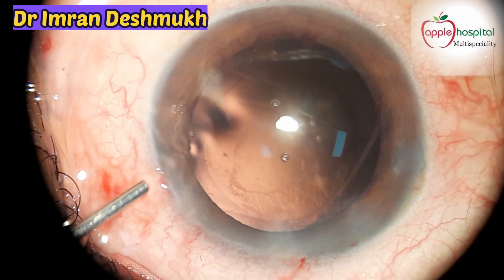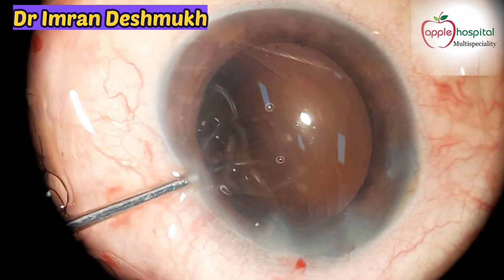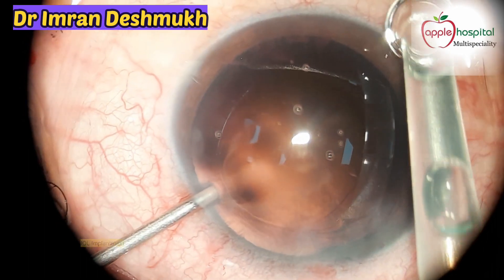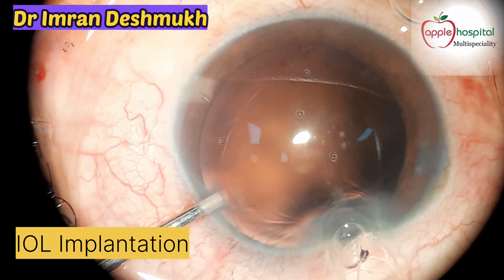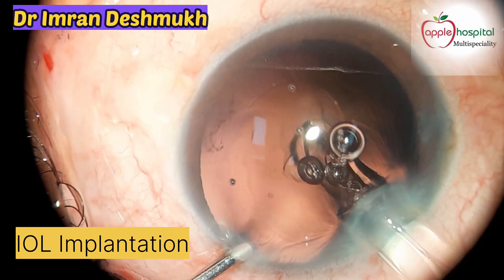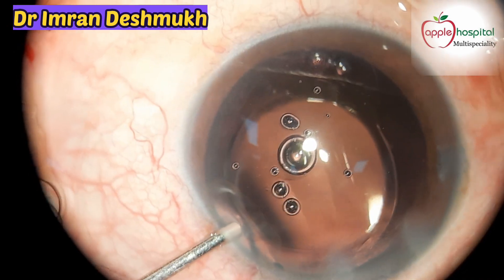Now it's time for implanting the IOL. We are using the technique of hydro-implantation — we use a 23 gauge irrigation cannula here, and this saves time and a few steps as you don't need to use viscoelastic. A single-piece hydrophilic lens is being used, with the leading haptic going in the bag.